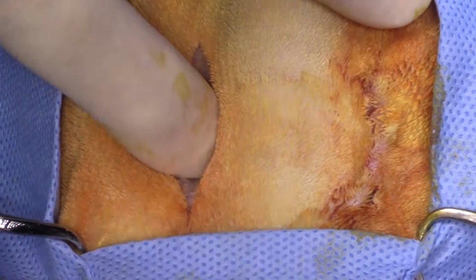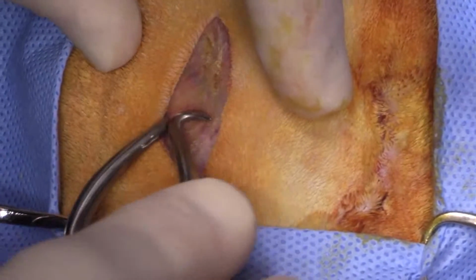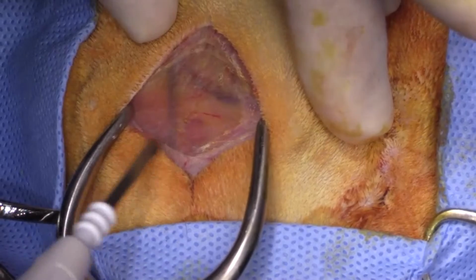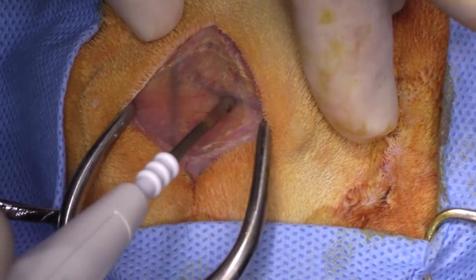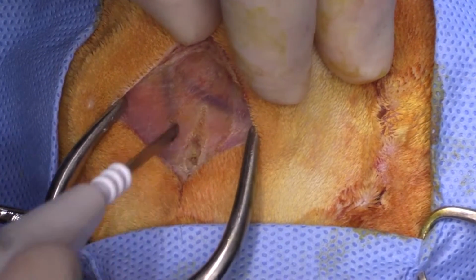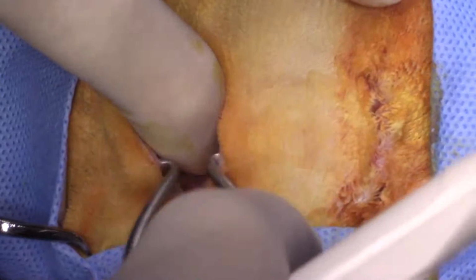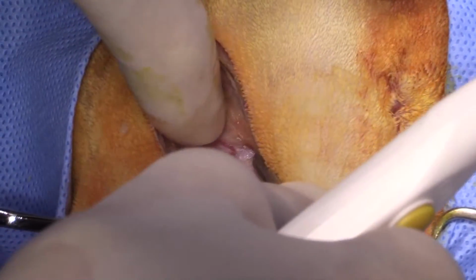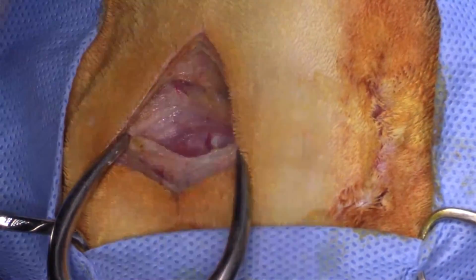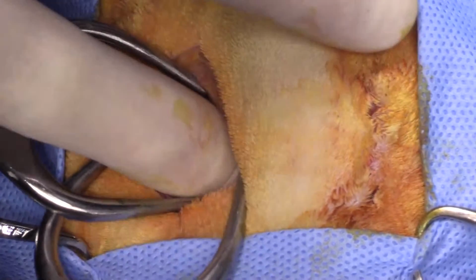Let me get my Gelpi retractors, please. We can see the linguofacial vein. So the facial is out here laterally, and the lingual is medial. And then palpating down again to my bulla. Can I get a Metzenbaum scissor, please?